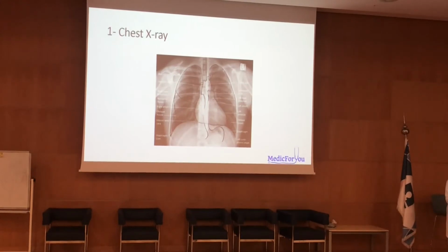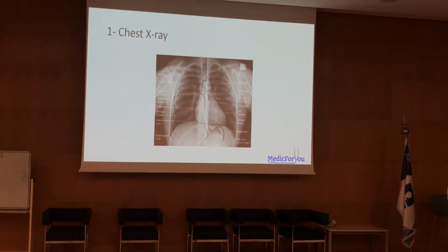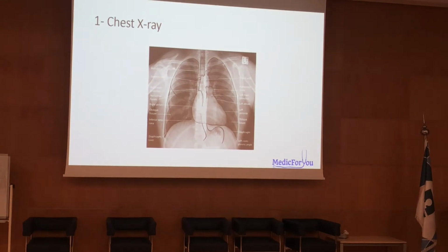Chest X-ray is very important, simple, with low radiation, giving a lot of information for cardiopulmonary. And I know this is clear to you. So as you can see, the heart is in the center and toward the left side. You need to know the anatomy and the position of each structure in X-ray to be able to make a diagnosis in case you have any chamber enlargement or vessel dilatation, along with calcification.